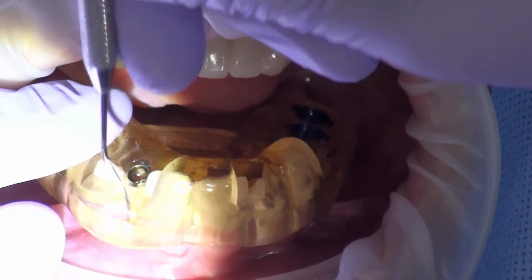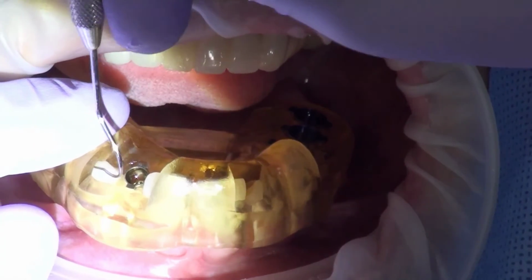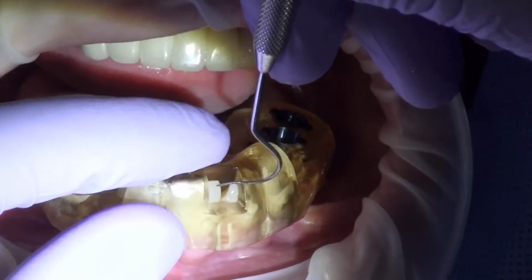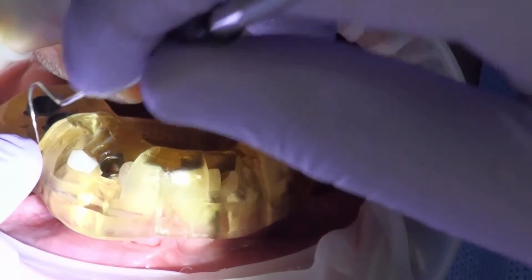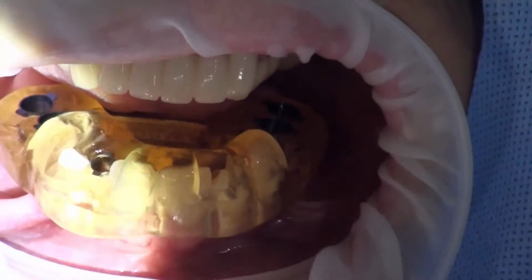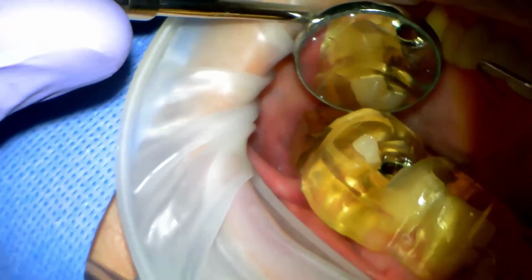And then my eye likes to look right around here, make sure it's sitting nicely, buccal contour. You're seeing same thing right here, same right over there. And if I get a mirror, you can check the distal areas as well. All these little windows are there to help you visualize the guide seated everywhere. Real big for me if you can.